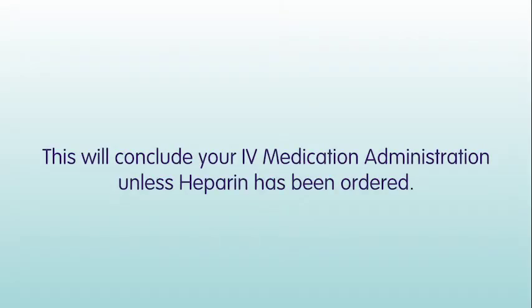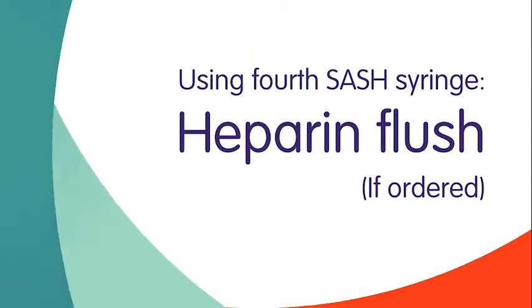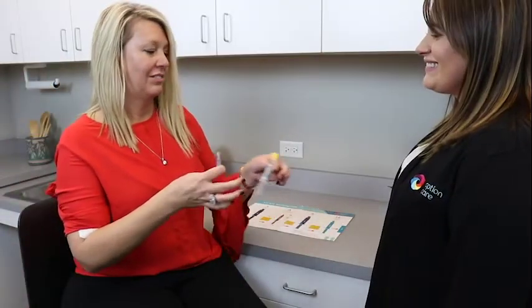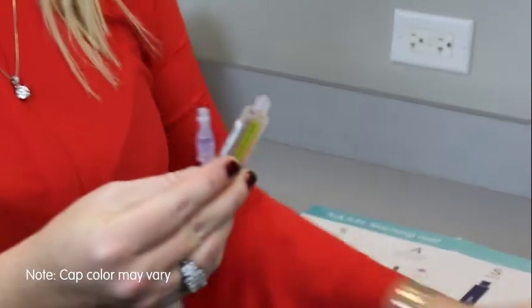This will conclude your IV medication administration unless heparin has been ordered. If ordered, you will need to flush your IV line with heparin. Scrub the needleless connector on your IV catheter with an alcohol wipe for at least 15 seconds and allow to air dry. Remove the protective cap from the heparin flush syringe.